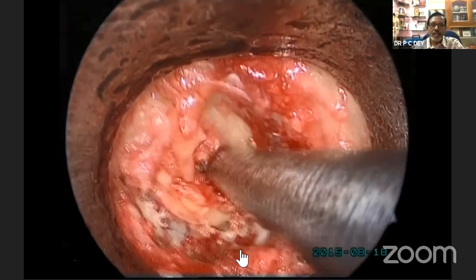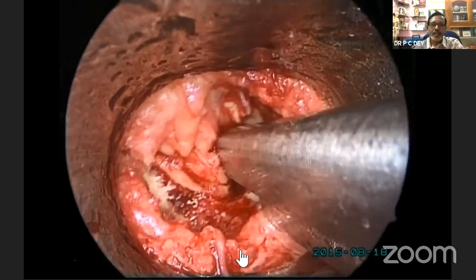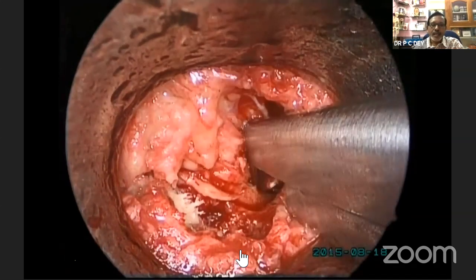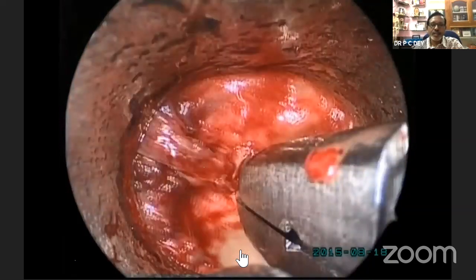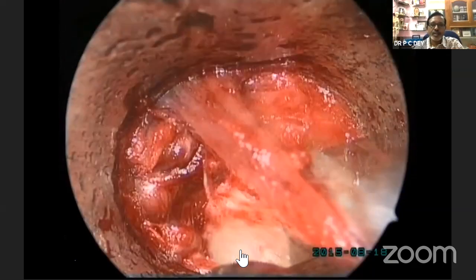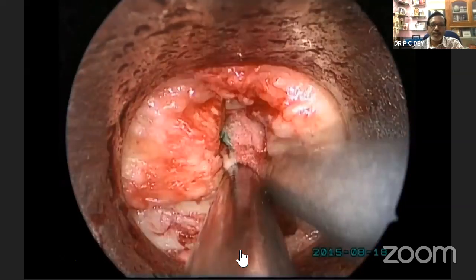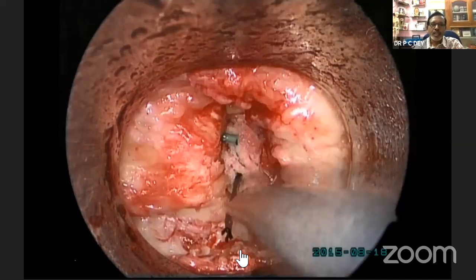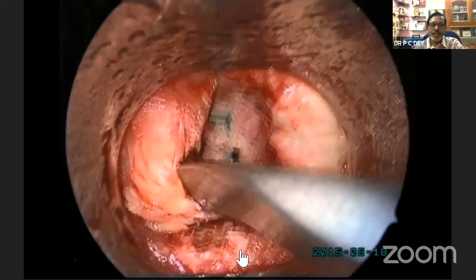And now the ligamentum flavum, or yellow ligament, is detached from the superior lamina here. Then gradually you come up to the facet, that is lateral. And this is your inferior facet, or S1 facet. This is the L5-S1 level. A small gauze piece tied to a thread, or you can use a neuropatty, protects the dura and the neural tissue here.